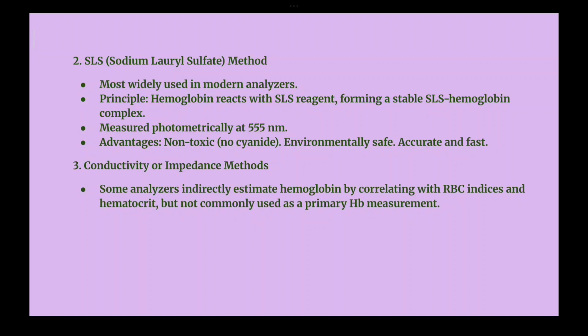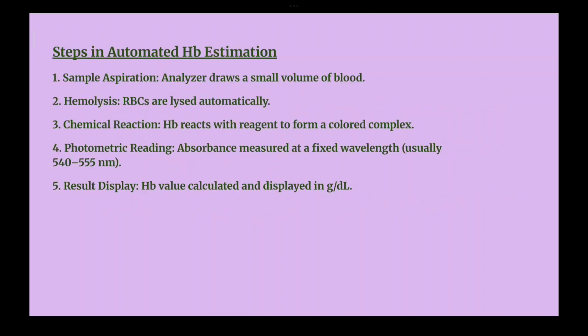So these are dependent upon the red blood cell indices, that is the number of red blood cells that are present, or various other methods like the packed cell volume, and even ESR can be used to estimate the hemoglobin, but these methods are not directly used to measure the HB.